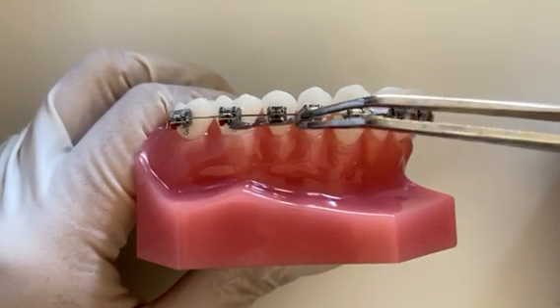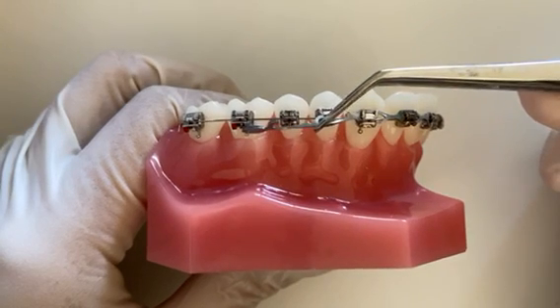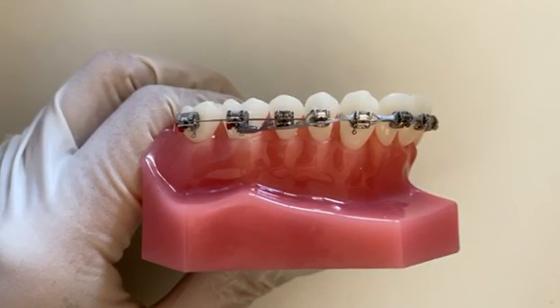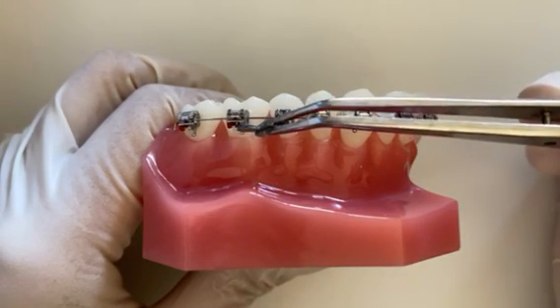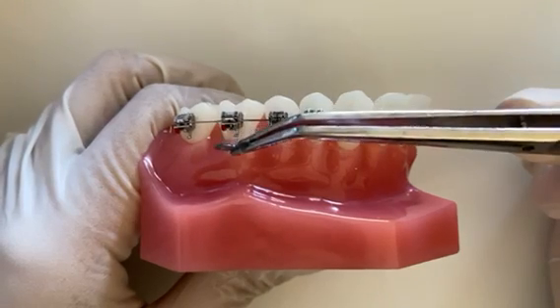If your power chain, also known as a stretchy chain around the brackets, becomes broken or snapped and is causing any discomfort, you can remove it. You can do this by using a sterile pair of tweezers or your fingers and start at the last link by unhooking it from the bracket.